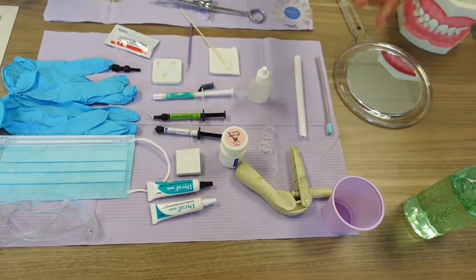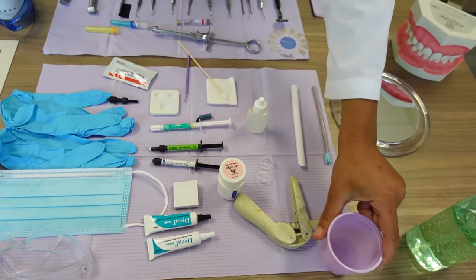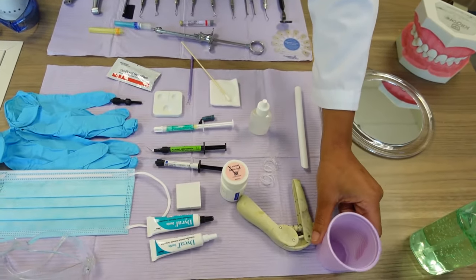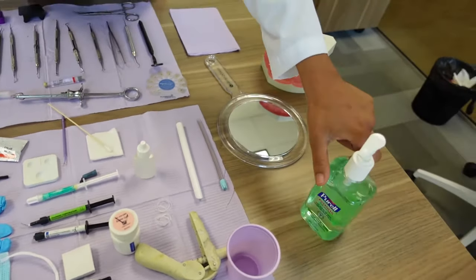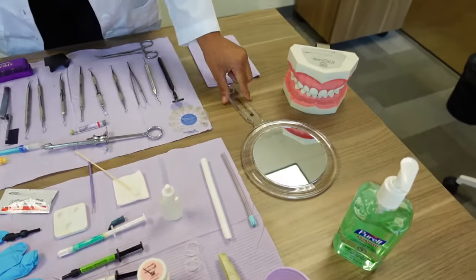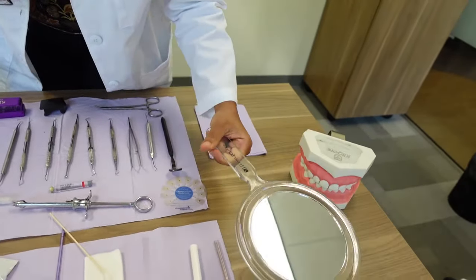I will use something like Breath RX. Breath RX is a great mouthwash because it's alcohol-free. Before the patient leaves, make sure the patient has hand sanitizer. They might want to take a look at the tooth, so we'll give them the mirror so they can see how great they look.